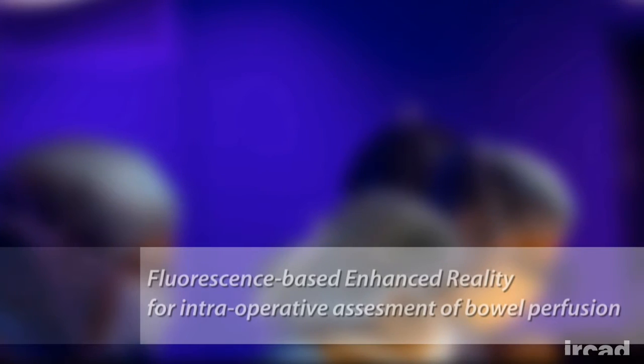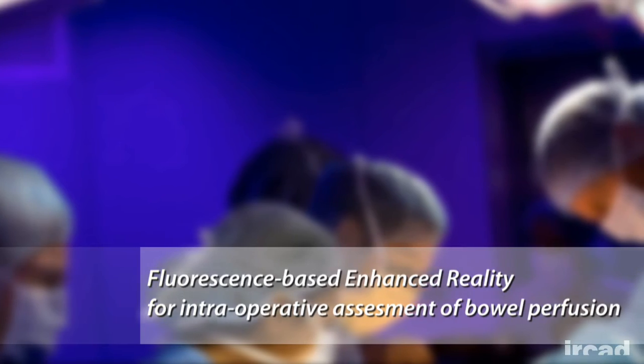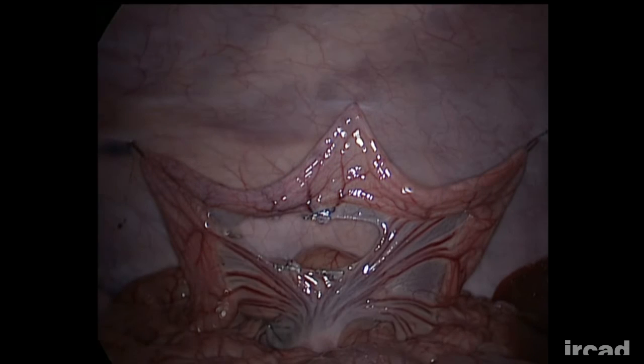This video presents the intraoperative assessment of bowel perfusion using fluorescence-based enhanced reality. An ischemic segment was created in a loop of small bowel and 0.5 milligrams per kilogram of indocyanine green was injected. 2 hours later, the D-Light-P laparoscope was switched to near-infrared mode to capture the fluorescence signal.